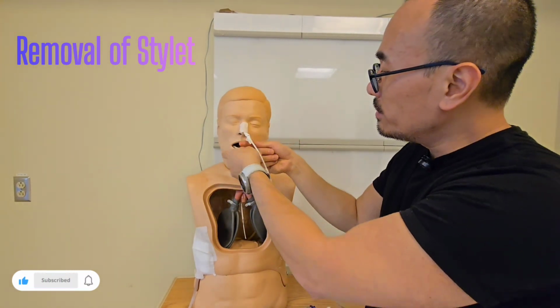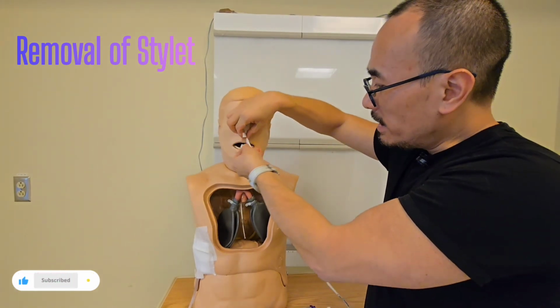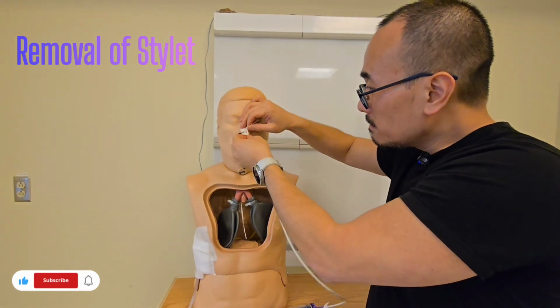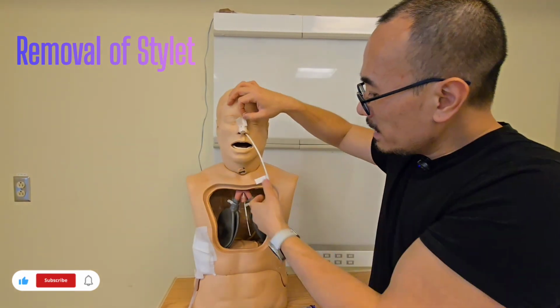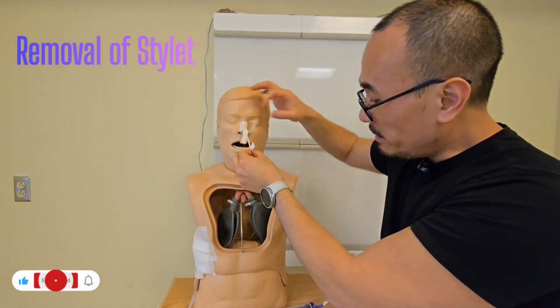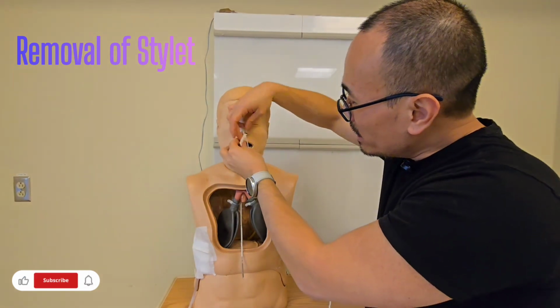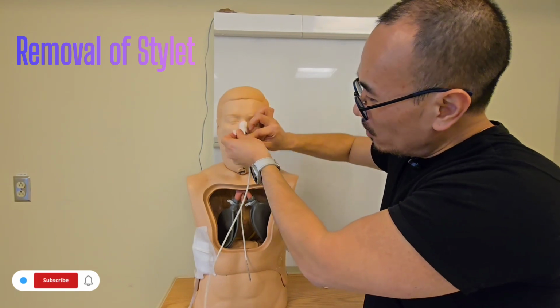Okay, so what we need to do is undo the initial dressing, because this one here was just to hold the tube down. Okay, and you're just going to advance it more, and look what happens to the tube. It just keeps going further down into the stomach. Once we have reached the second point, now you can use the dressing again, and really secure it and coil it down.